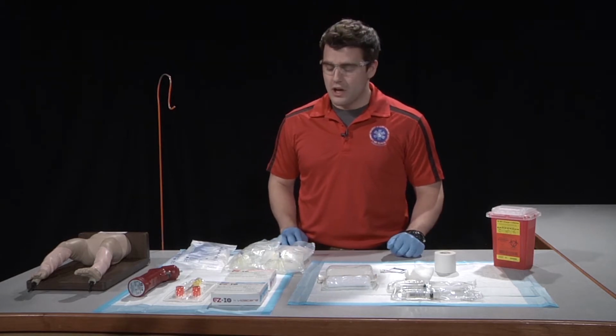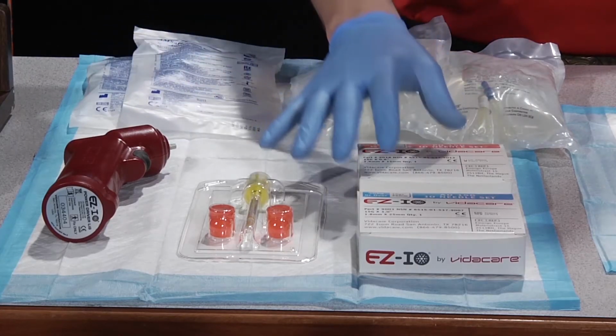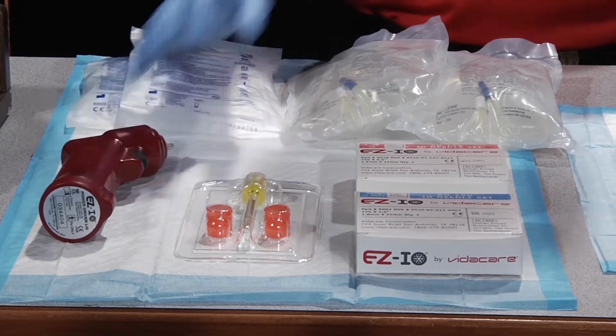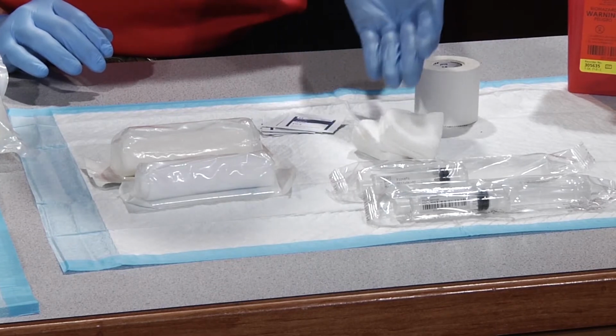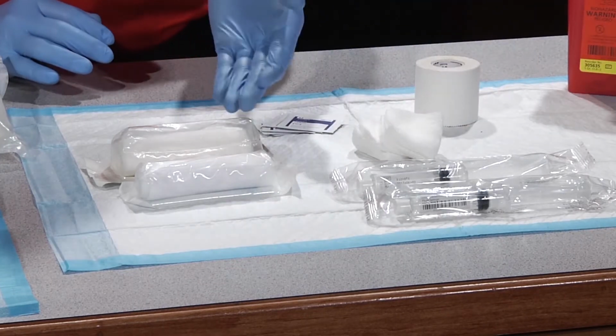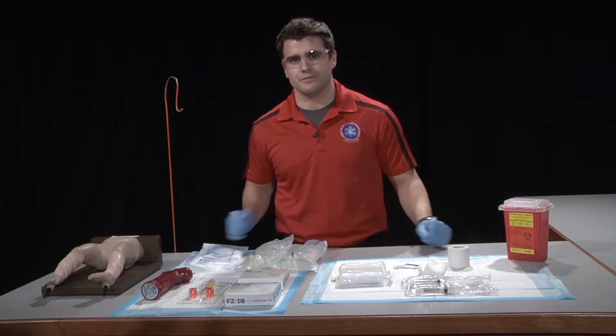For this skill, we will need IV solution, an administration set, our IO needles and insertion device, our sharps container, as well as tape, alcohol, gauze, syringes, and Curlex. You'll also need PPE consisting of gloves and eye protection.